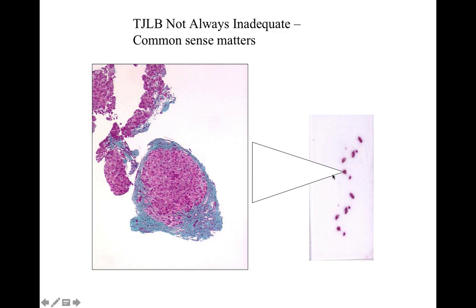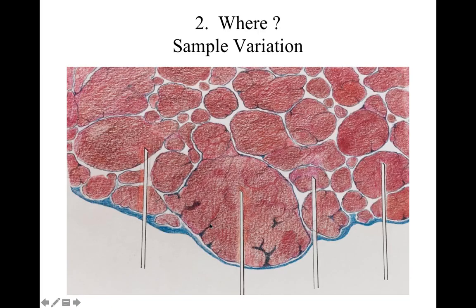Herein, as you see in this particular case, we got just one nodule, but it is completely enveloped by fibrotic area. So we'll be able to say that yes, this is cirrhosis, and whatever problem the patient is having is because of this advanced fibrosis.